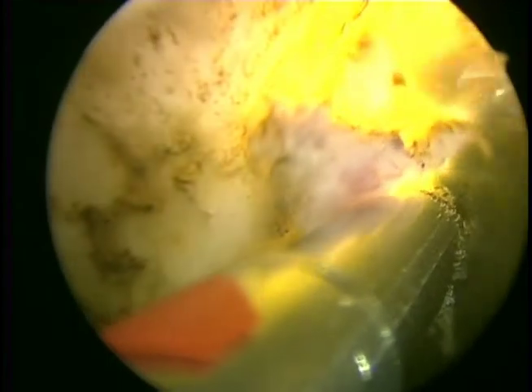Here we can see, rather than creating an 11 o'clock groove, we'll come back, reverse our positioning of our camera to allow the fiber to come to a 1 o'clock position, but aim toward the 11 o'clock direction so we can surf the capsule heading in the opposite direction. This will allow, again, the continuation of a nice smooth capsule and the minimization of potentially going through the capsule since we now know where it is. Again, just following a pre-established surgical plane, it's simple, it makes sense, and it leads to better outcomes and least complications.